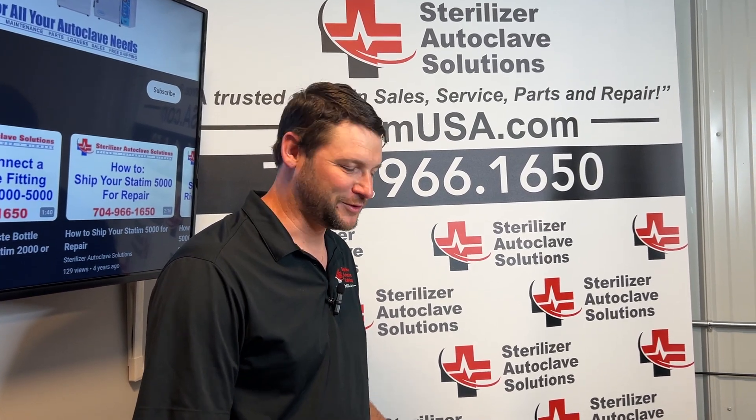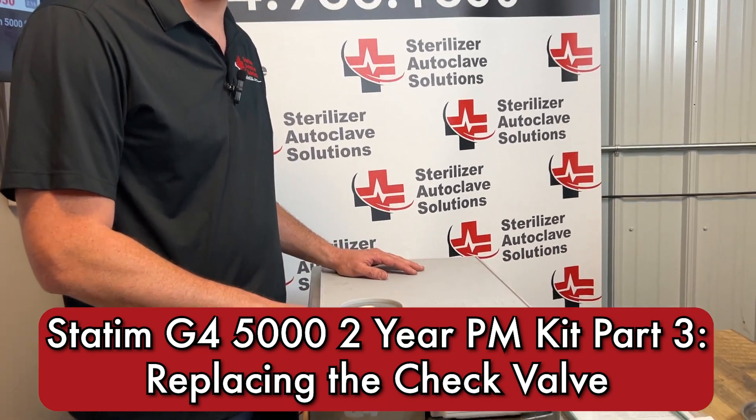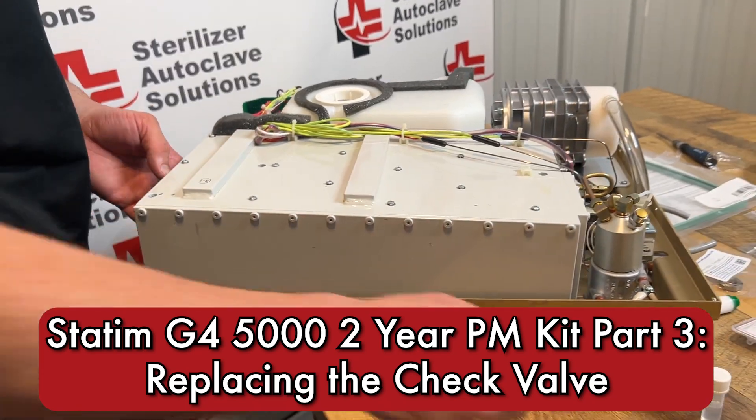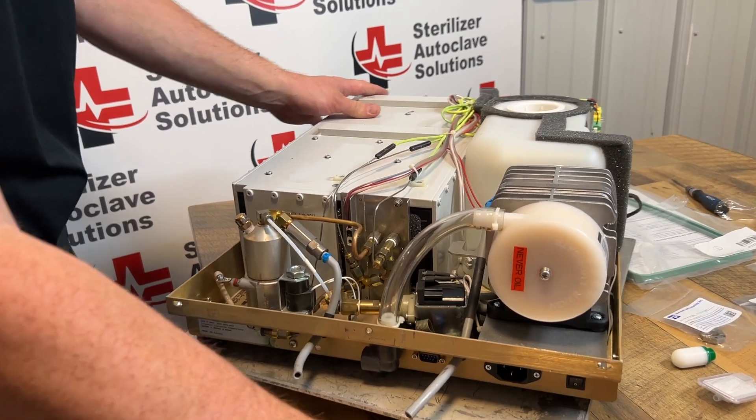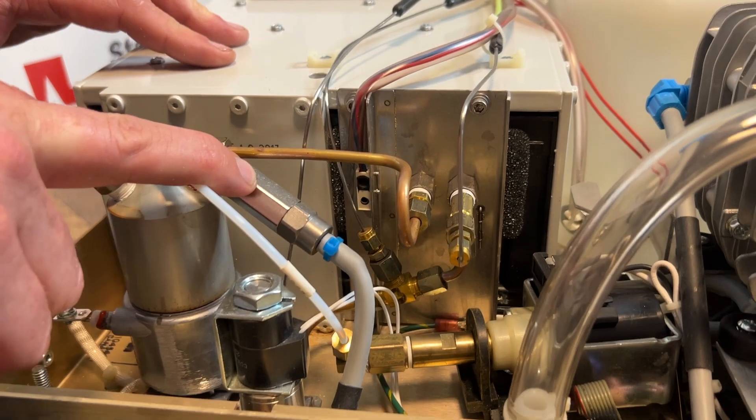Hi, this is Ian with Sterilizer Autoclave Solutions. Today we are doing our two-year preventative maintenance on a STATUM G4 5000. At the back of the unit is where we're going to be focusing. We have our check valve, and this is on our two-year PM list.